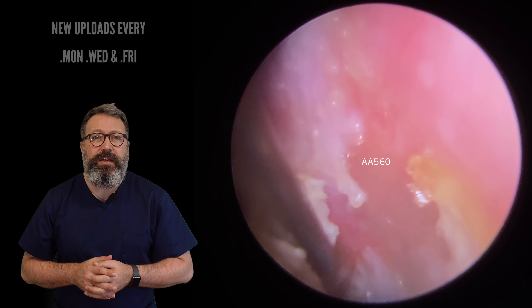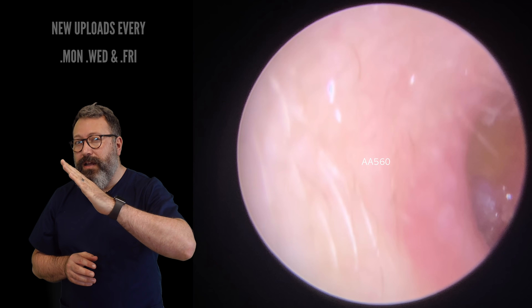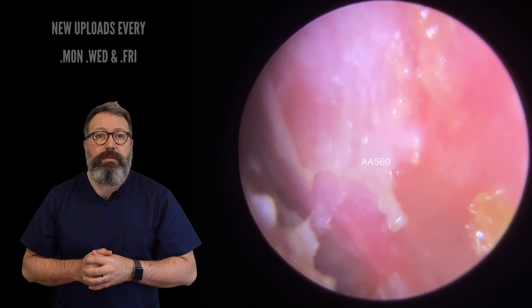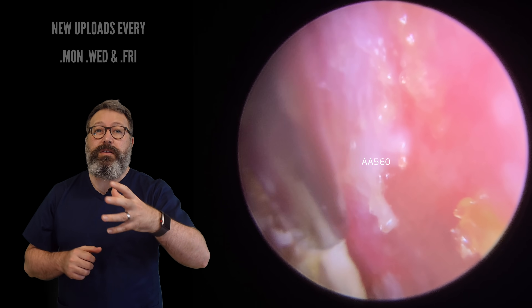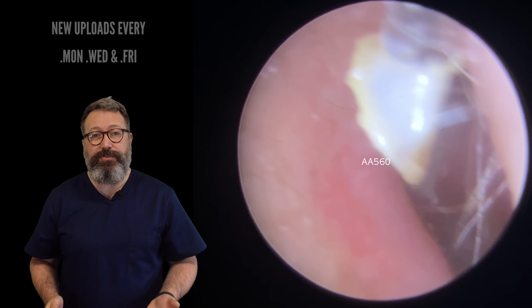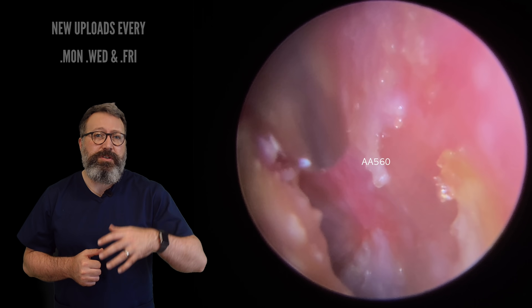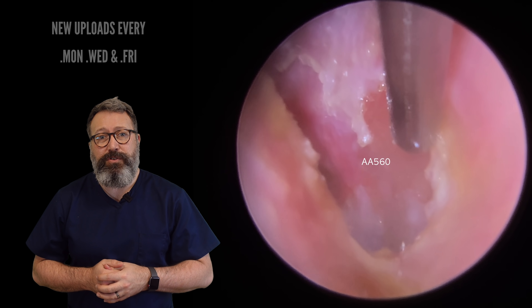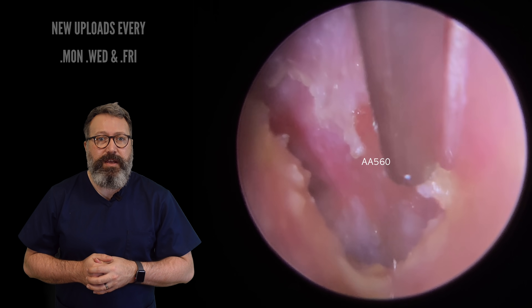It's very difficult to discern the anatomical features of the eardrum we'd normally look out for. We're actually working just below the hammer bone there, now up to the tip of the hammer bone — you can just see that kind of pink diagonal line there, that's actually the hammer bone itself. Slowly peeling all these bits away. Is this painful for the patient? This patient's had so much work done on their ears over the years, they can sit through and tolerate this really well. Some people may struggle a little bit with these deeper sections, but this patient is such a trooper — they've sat through so many different bits and pieces and they've got confidence that we can remove it because we've done it multiple times.